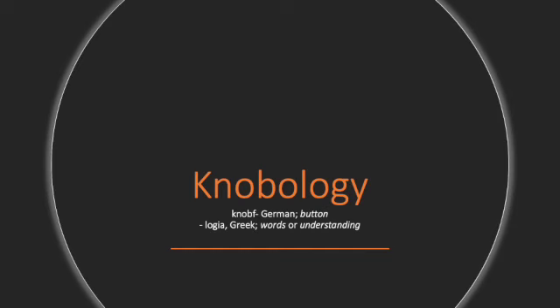Today we're going to talk about knobology. Now I'm not sure if this is a real word or not, but it is commonly used in ultrasound to talk about how you get the machine to do what you want it to do.